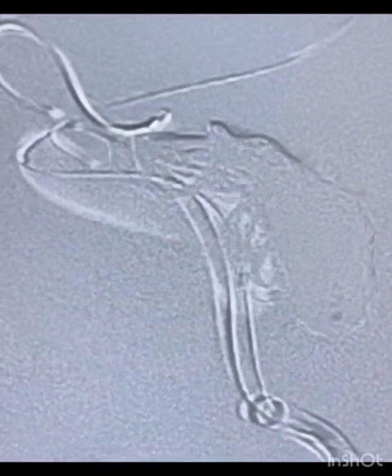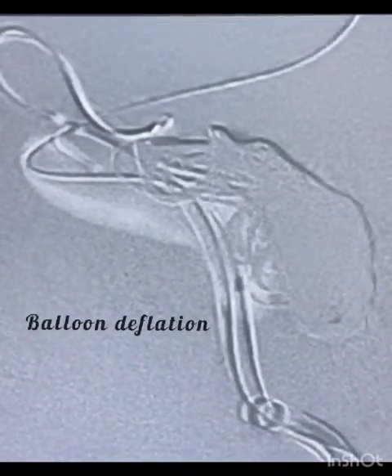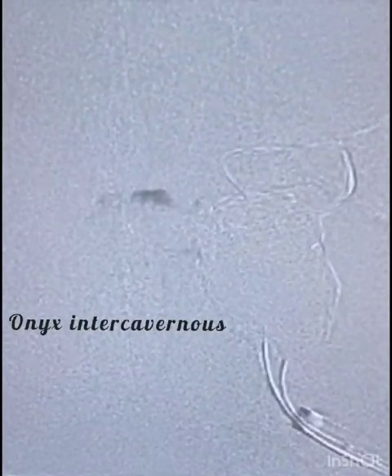Following that, Onyx was injected under biplane fluoroscopy with balloon inflation to avoid Onyx reflux into the parent artery. Note the spread of Onyx in the intercavernous sinus.